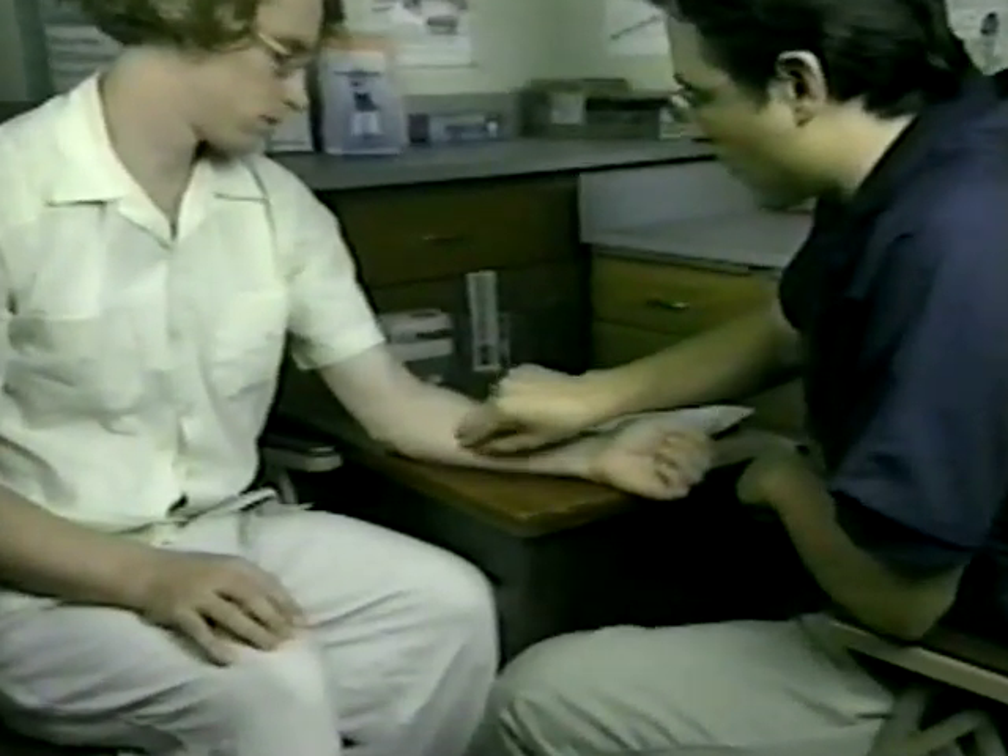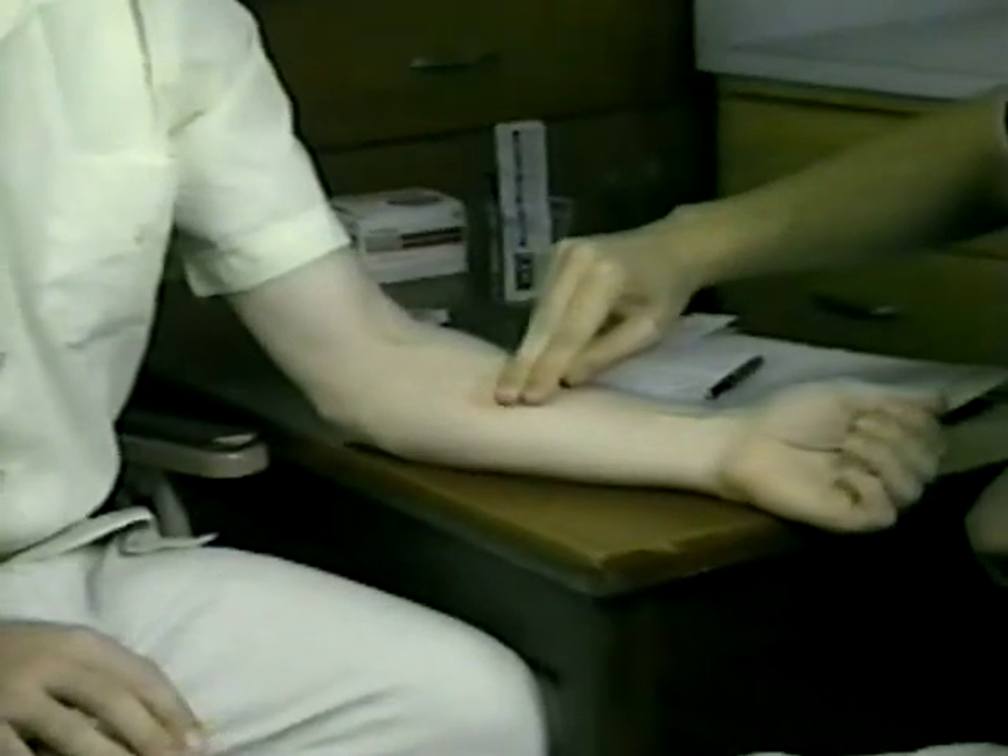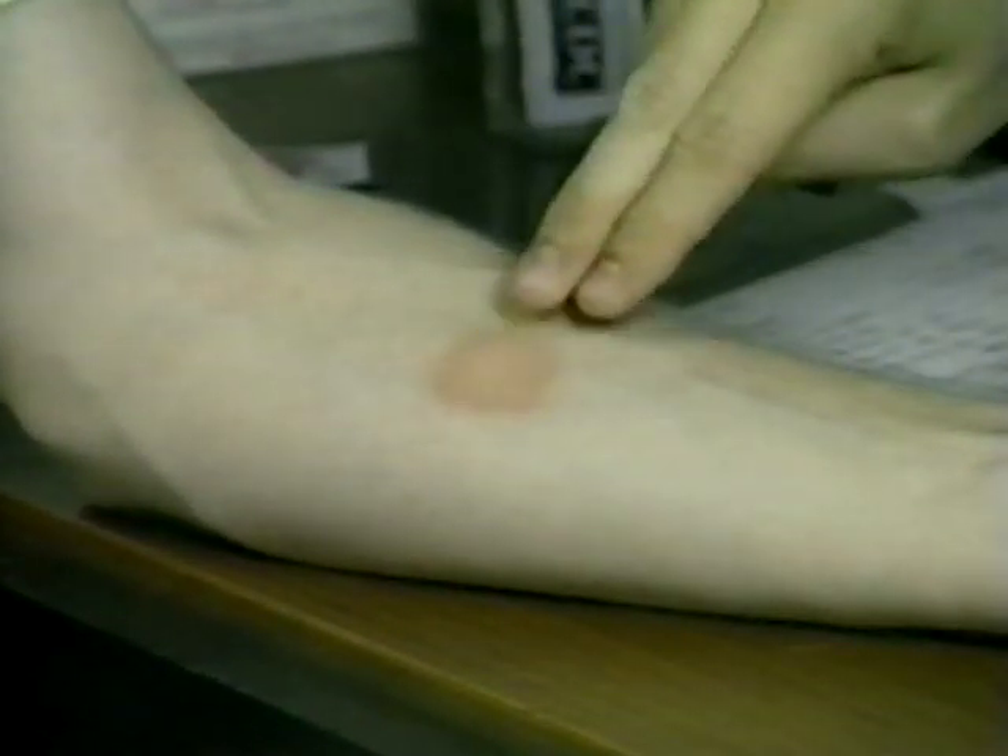There is redness and swelling in this reaction, but there is no induration. Because only the margins of induration are significant, the redness and swelling should not be mistakenly measured. Therefore, the measurement of this induration is 0 millimeters.